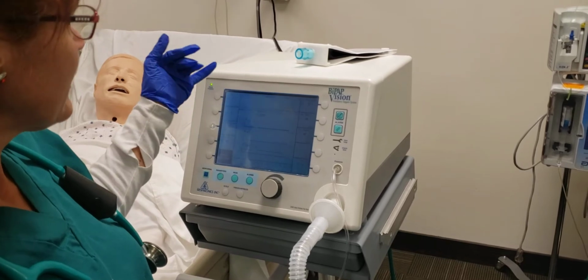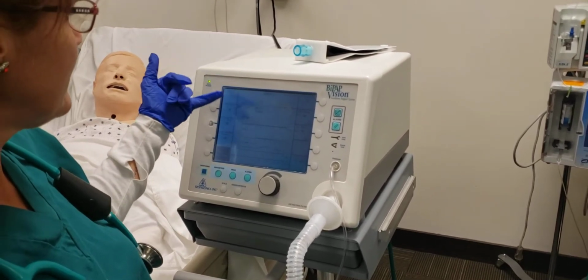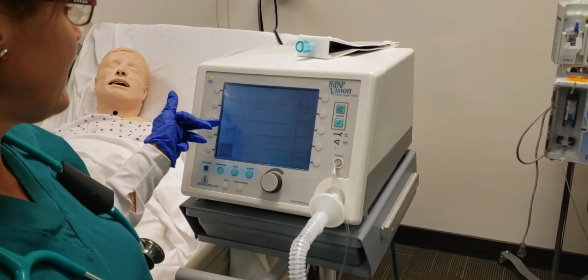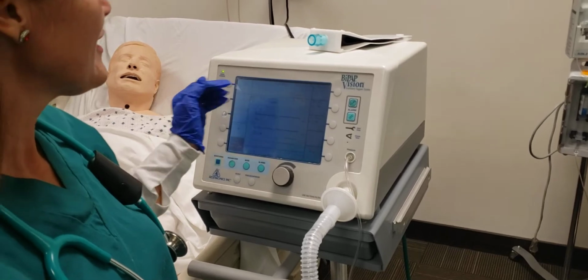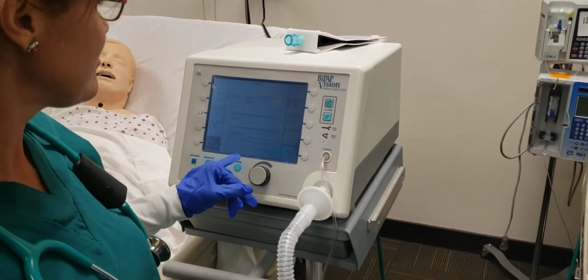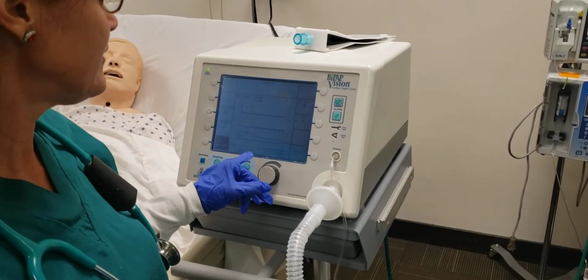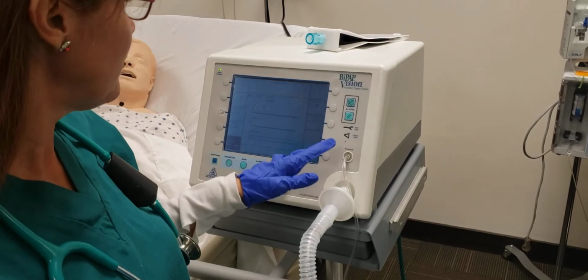For the pressure, we're going to set 2 above and 2 below. So for 5, that would be a 7 and a 3. We're going to keep a delay pressure low for 20 and the apnea for 20. The minute ventilation is actually going to go on what the patient's doing. It's going to be 20%. Your high rate, we would do a 30, and the low is a 12.